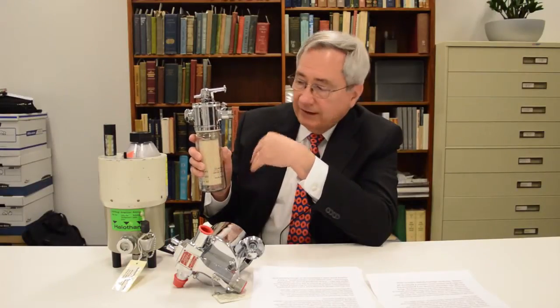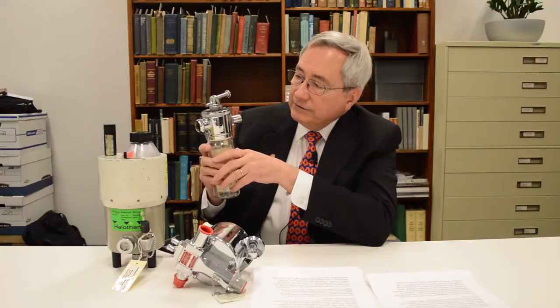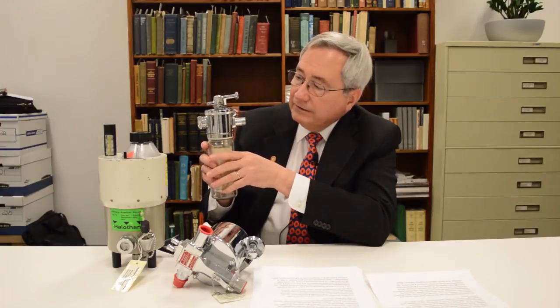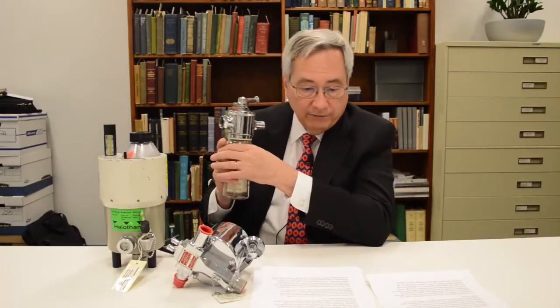The water condensing on it would further reduce the amount of anesthetic that was being added to the anesthetic gas mixture coming out. So it certainly could be used. It was used for a number of years, but it did have some limitations, and its ability to deliver a highly controlled concentration of anesthetic agent was rather limited.